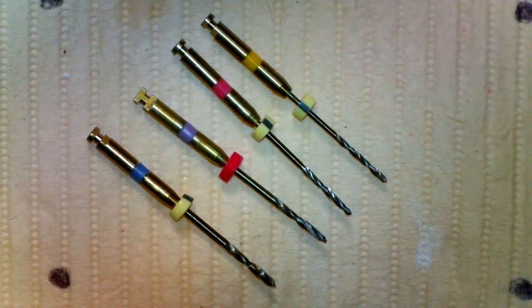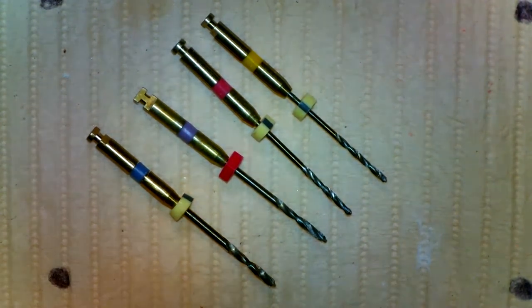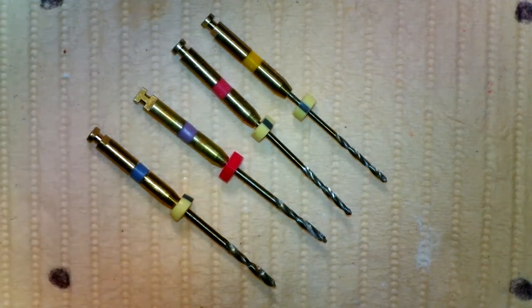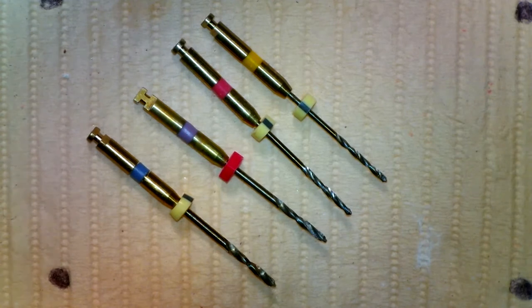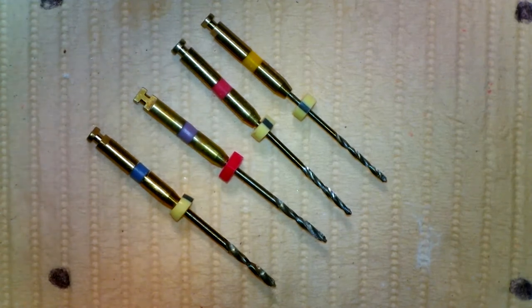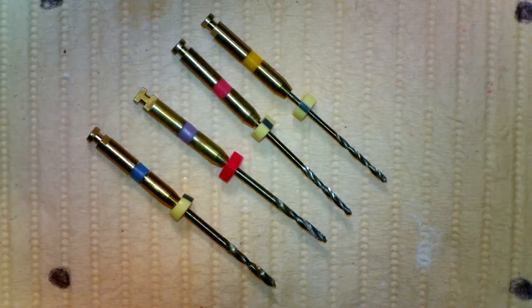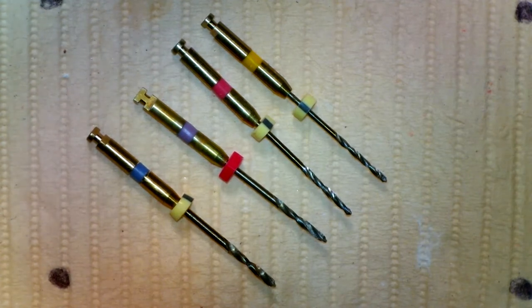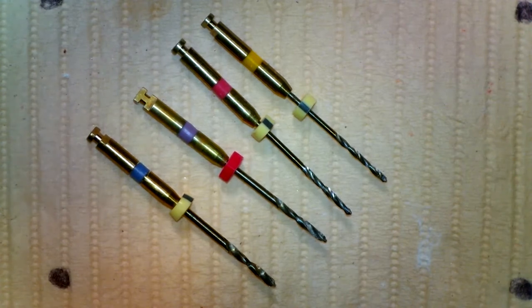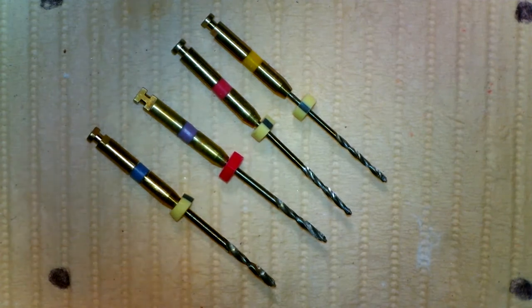We know the length of the canal is 19 millimeters from the marginal ridge, so we're going to use that as our reference. Since we have to leave at least 5 millimeters of gutta percha, 5 from 19 is 14 millimeters. The length of the post is 15 millimeters, so we'll probably cut a millimeter or two off.